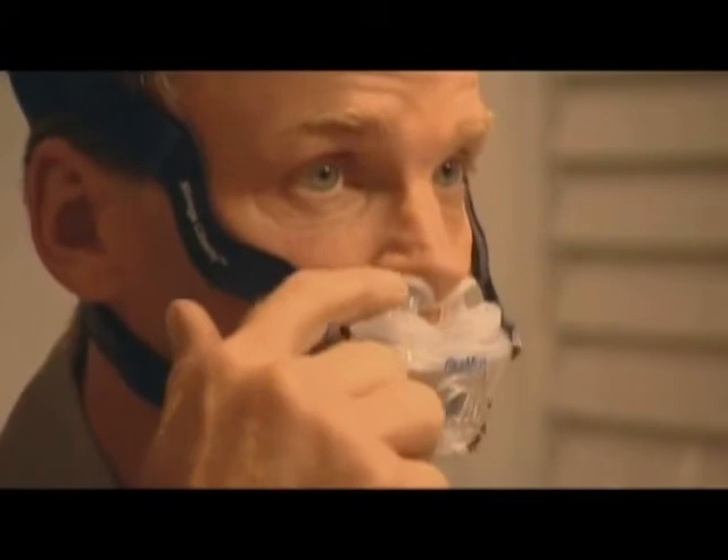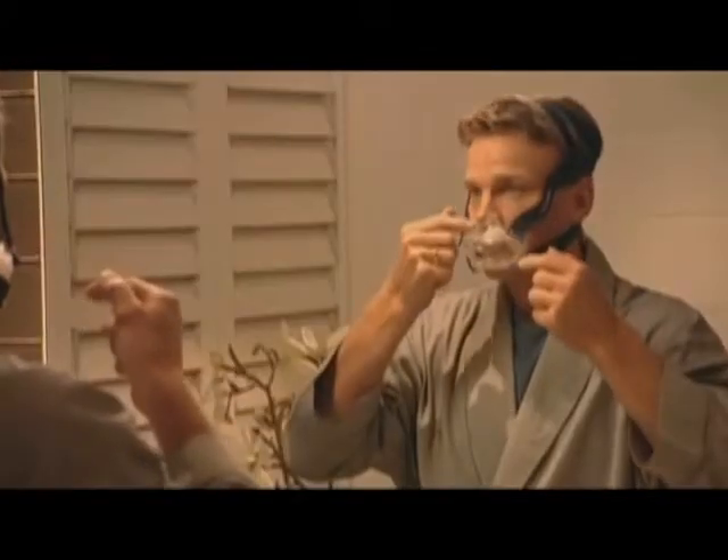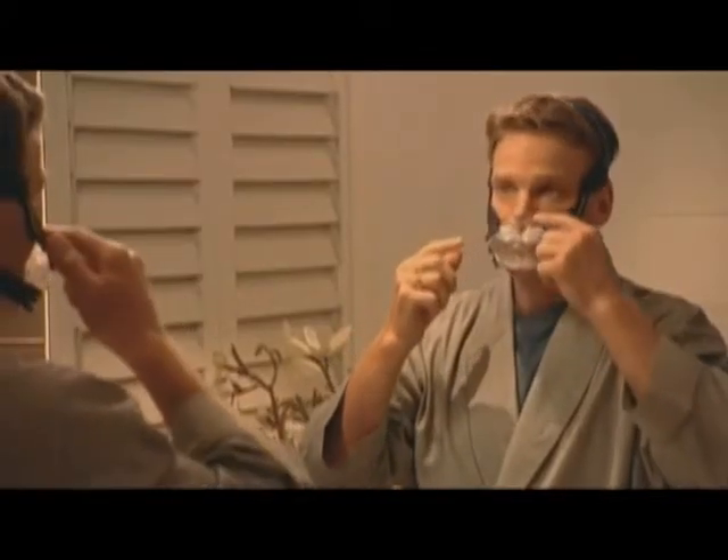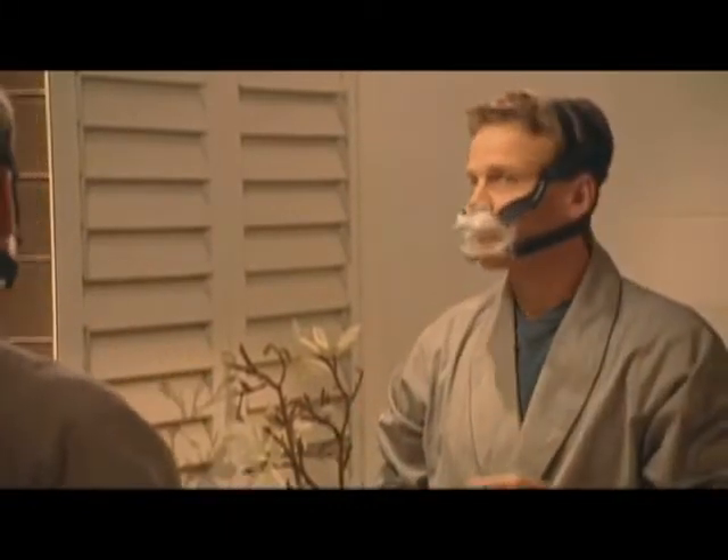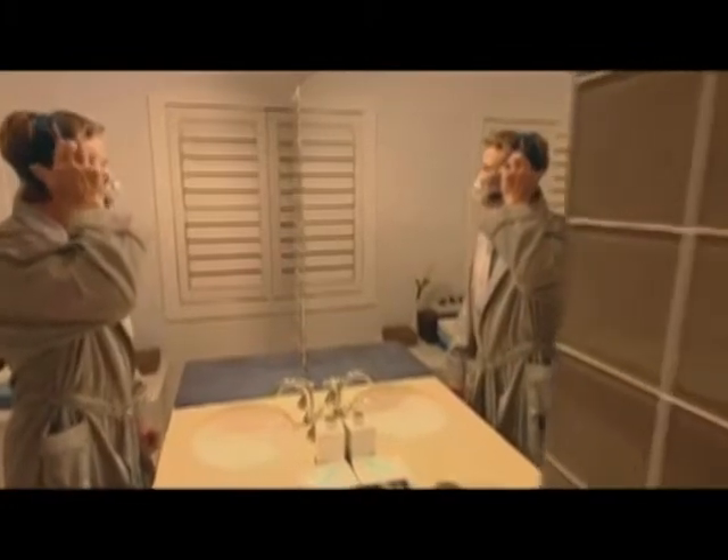Now adjust your nasal pillows by gently aligning them with your nostrils until you feel most comfortable. If you have any difficulty at all finding a perfect fit, please consult the troubleshooting section of the Mirage Liberty user guide.